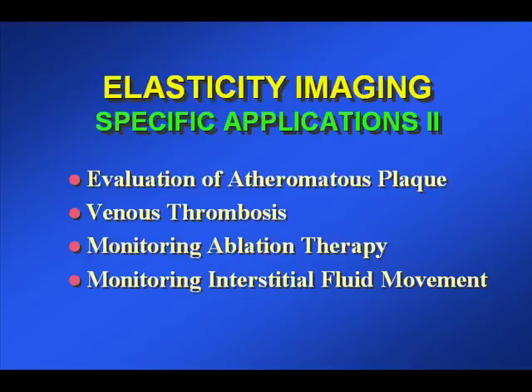Monitoring of ablation therapy is a very opportune method because ablations always produce markedly increased stiffness of tissue, and since imaging modalities have difficulty imaging the ablated tissue reliably, elasticity imaging may be the solution to this problem. And finally, monitoring of interstitial fluid movement, such as in various types of edema.